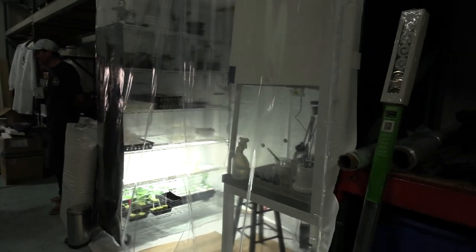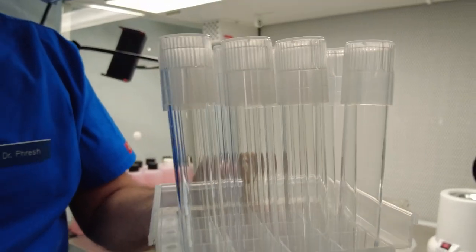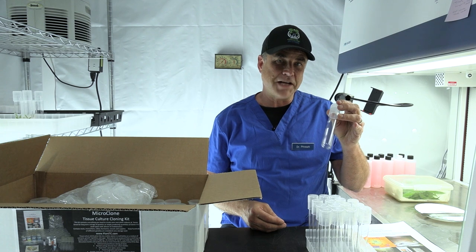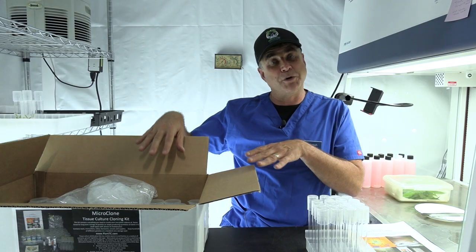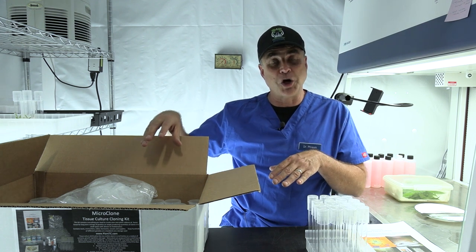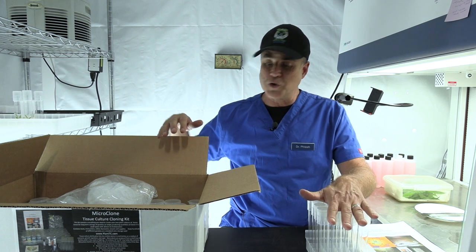This shows you just how easy this is for you to do at home. First thing you'll come across is the instructions with the parts list. First thing out of the kit, I've got a tray of eight glass tubes, each one with a clear plastic lid. These are all autoclaveable, and the tray is autoclaveable too. These are the vessels you want to use the first time.